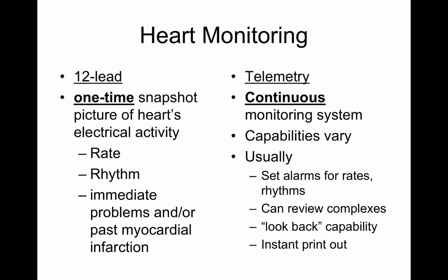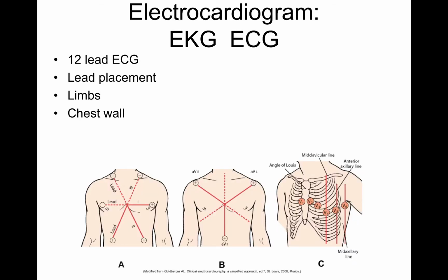So if you want to see how your patient is doing, if they're saying they're not feeling well, that they feel very faint, you can look at the telemetry monitor and actually look at their heart rate and see the tracing.